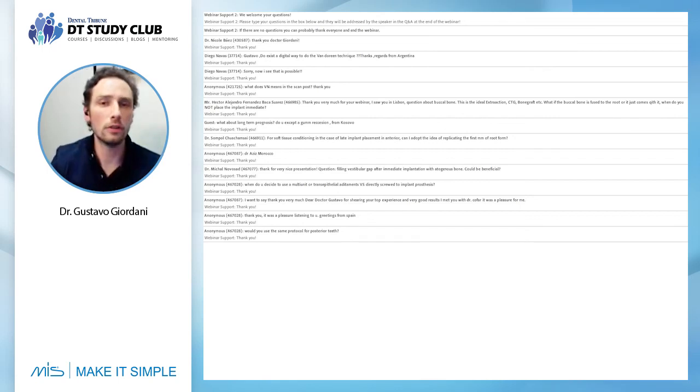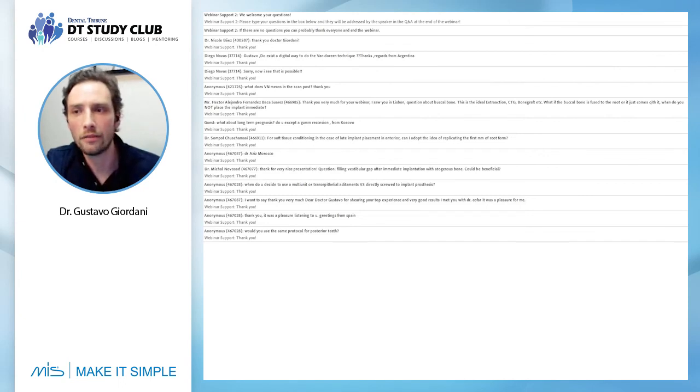We have a very good bone stability with this. And then on top of the Connect, you try to create the restoration. I don't have more than 6 months to 1 year of experience, but I'm seeing and checking very nice results. And as I see from Nitzan Bichacho, from Victor Clavijo, from Eric Van Dooren, it looks very, very good. Also, Linkevicius is showing a lot of good results with Connect. So I think this is a very good and intelligent and smart decision to do.